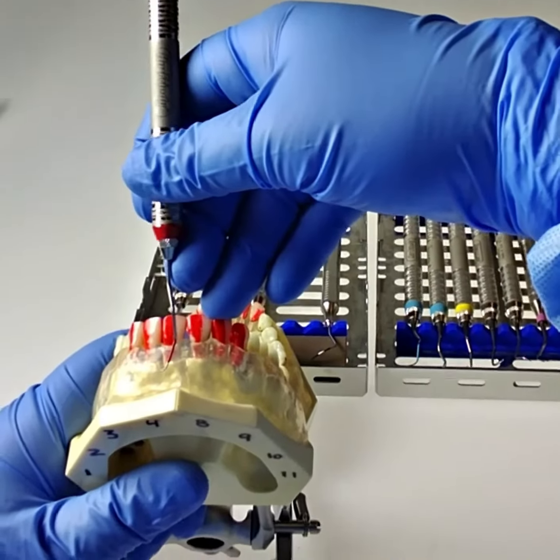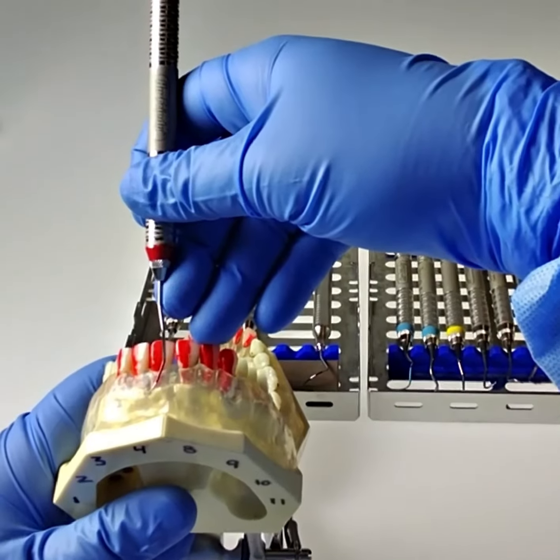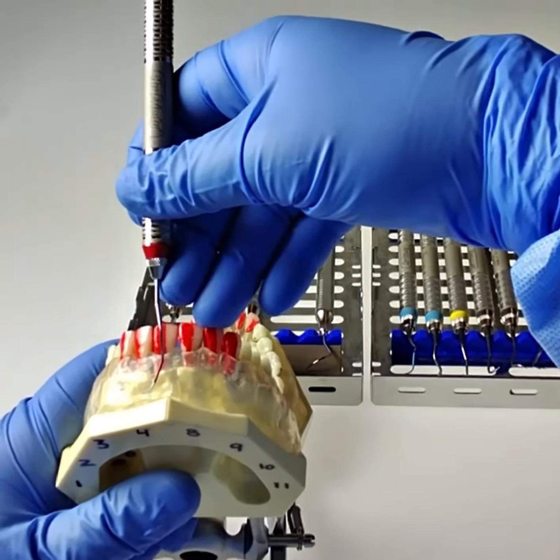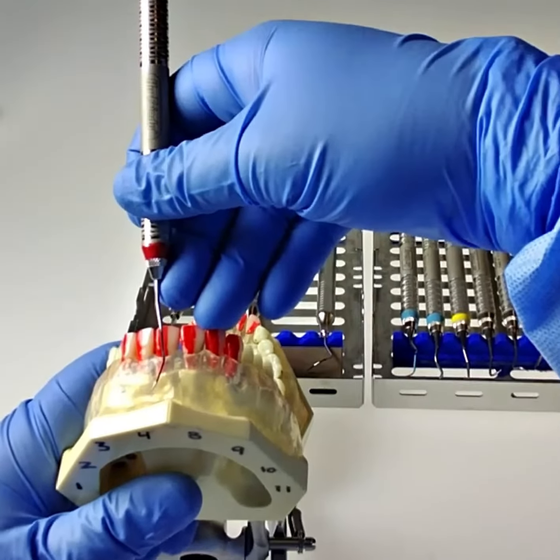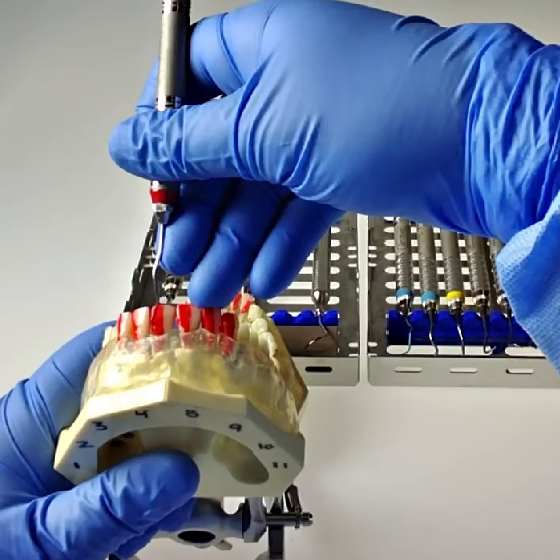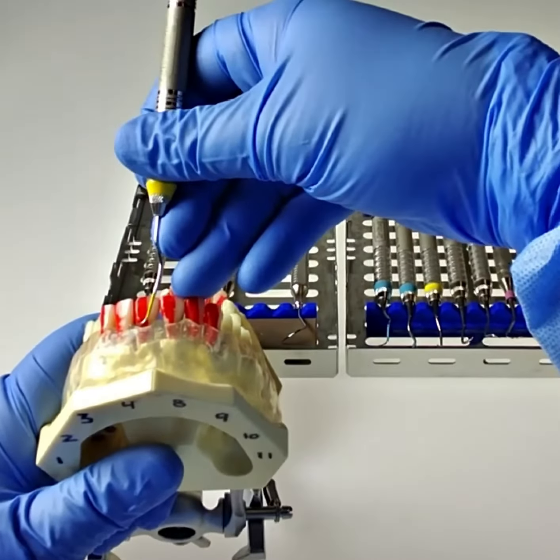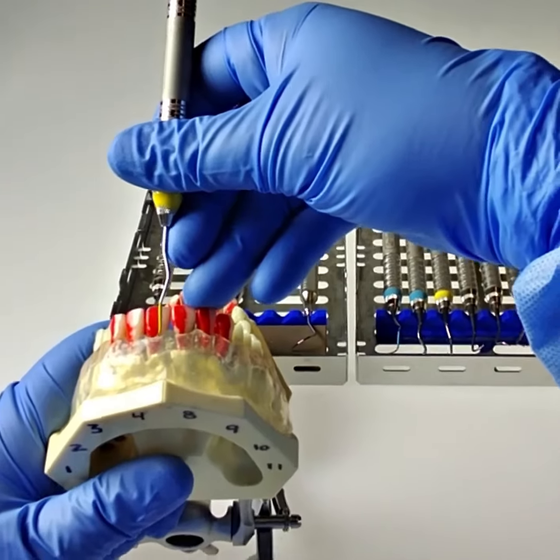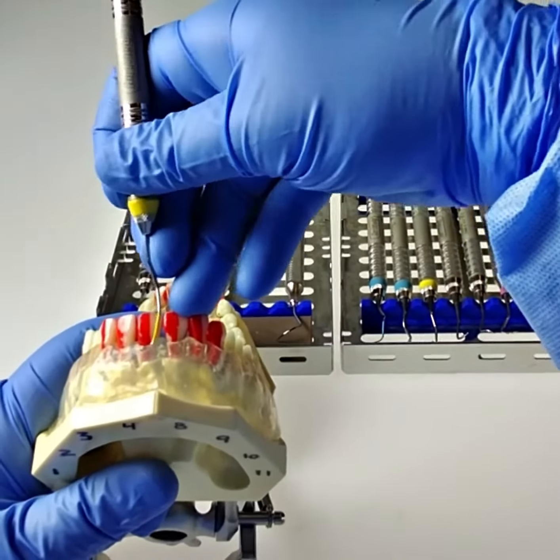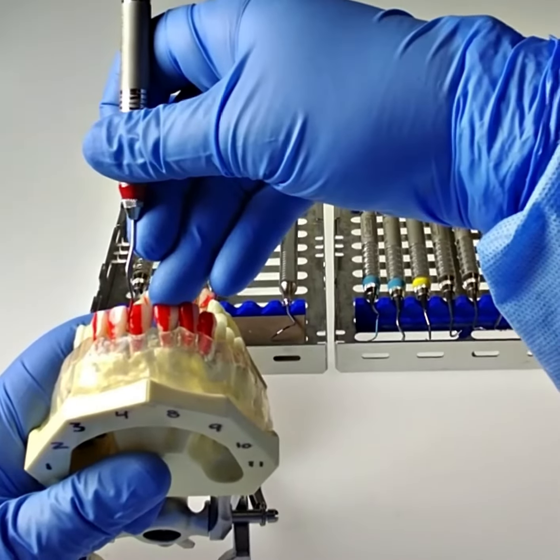To use the 1112 Explorer in the anterior sextant, first you have to find the correct working end. Hold the handle parallel to the long axis of the tooth and pick the working end that hugs the surface you want to address best. The incorrect working end will have a toe that flies off the tooth and snags the gum tissue. The correct working end will hug the tooth nicely.